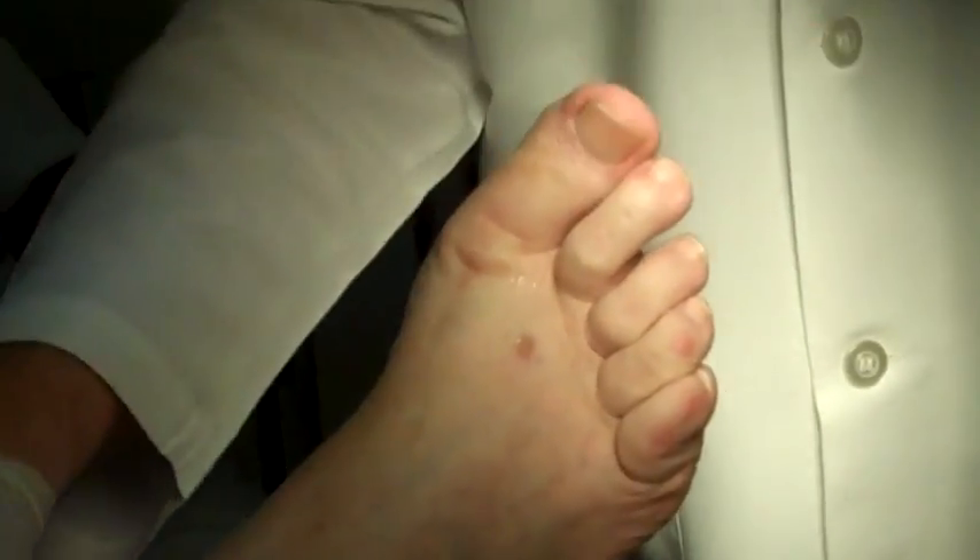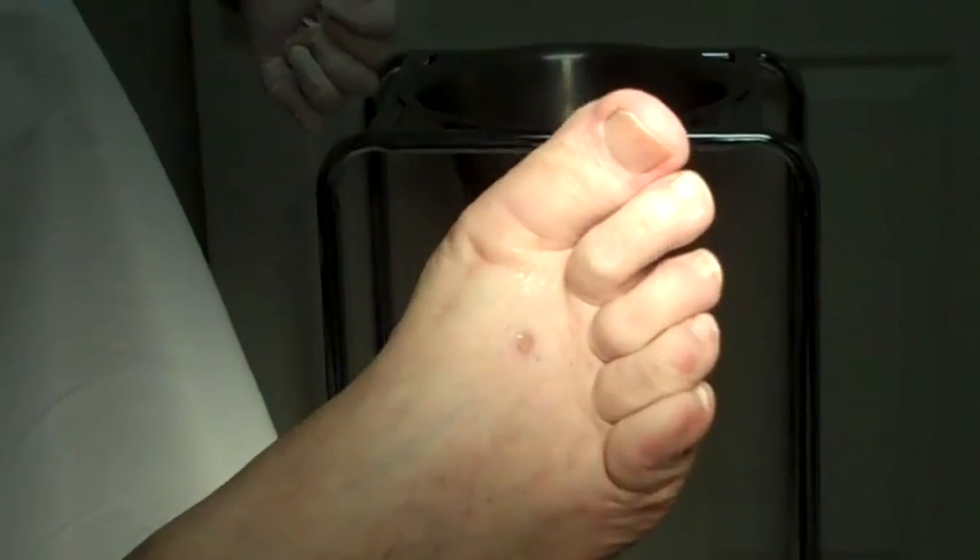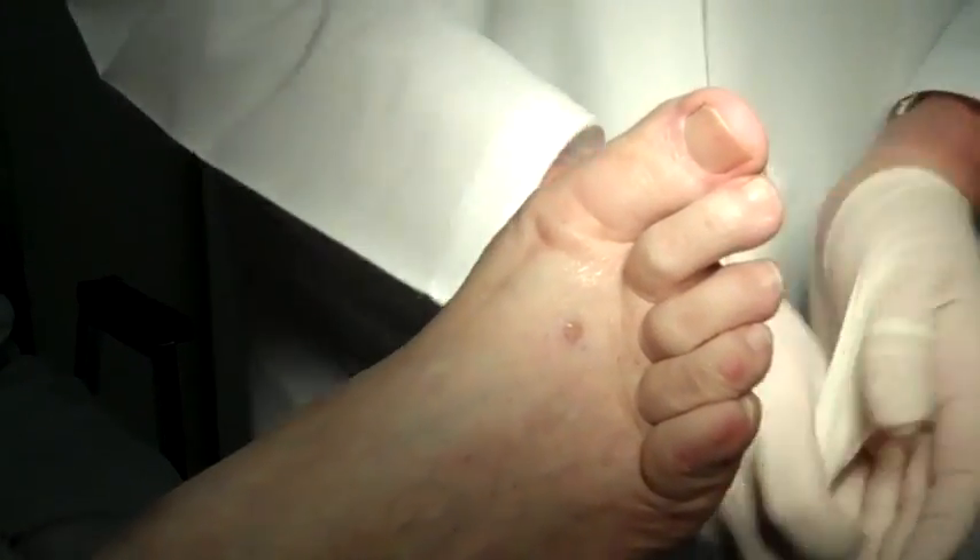She's going to scrub your foot. I'm going to give it a few minutes — we give it about eight to ten minutes normally to get numb. Although you should already be able to feel some of the numbness in there. In fact, if I touch it back here, it should already be starting.